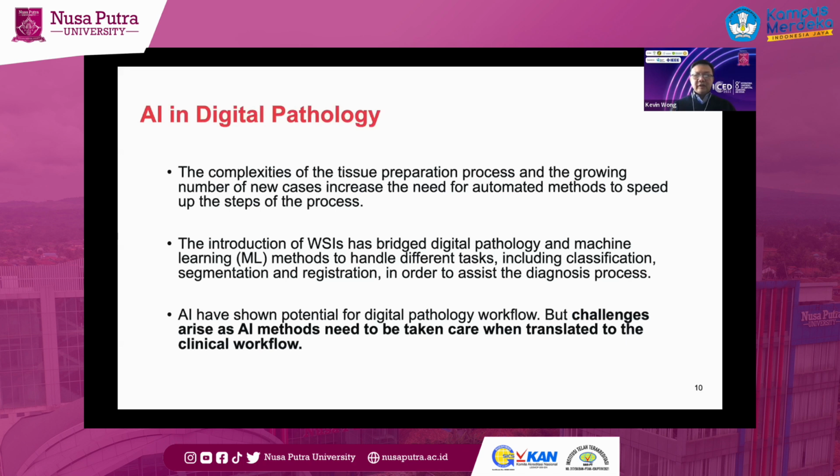It is some kind of cat and mouse chase. That's why machine learning is especially useful in the digital pathology workflow, for example classification, segmentation, and registration, which can contribute to the tasks I have illustrated just now.